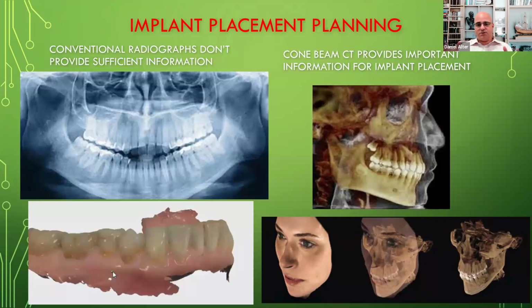That not only gives us a lot of information as to what it is that we're trying to accomplish, because the more information we have, the easier and better it is for us to get to the end result.